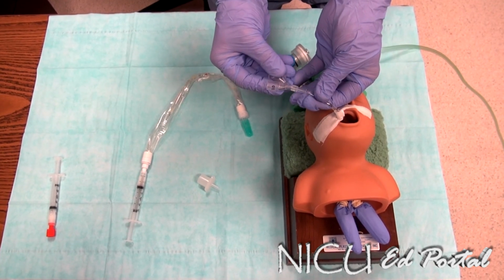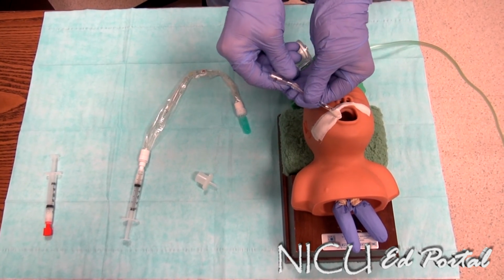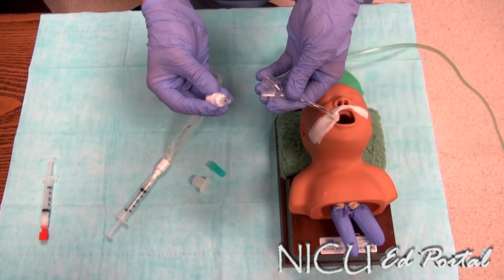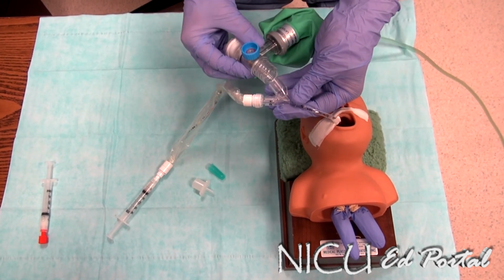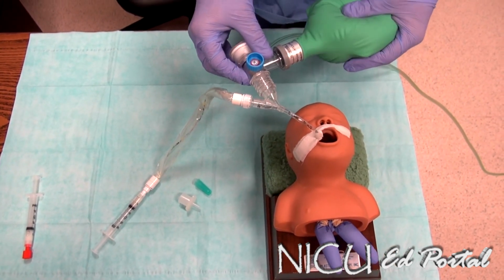We will place that in the 3.0 endotracheal tube. Then we will take our catheter, remove the blue cap, putting that end in the smaller port, and then reconnecting our bag to the larger port. And at this point we can resume manual ventilation, like so.